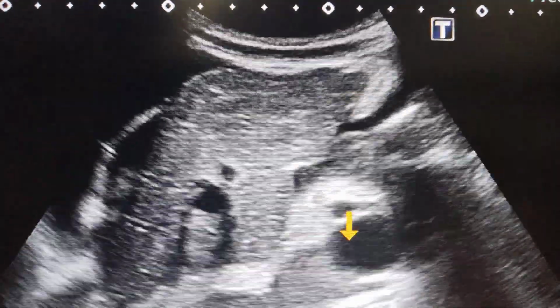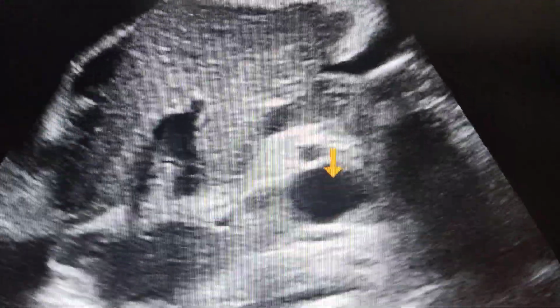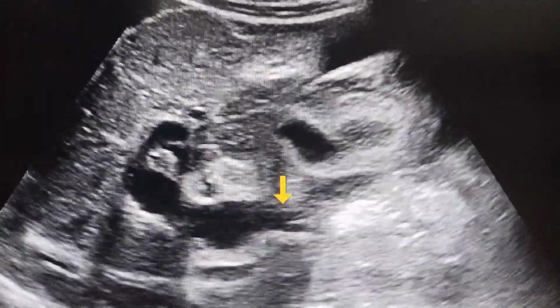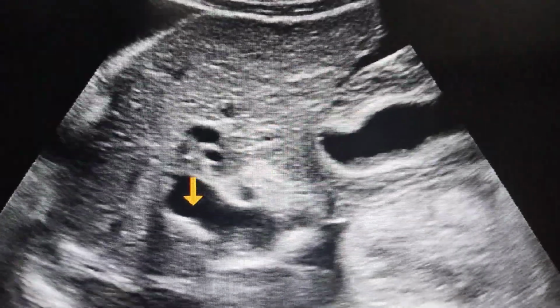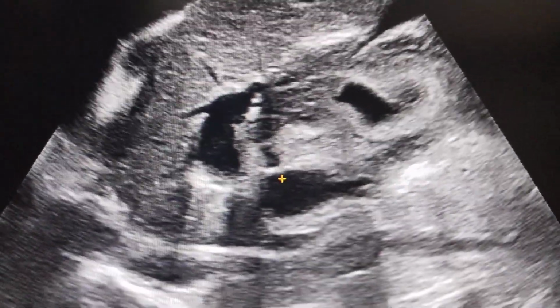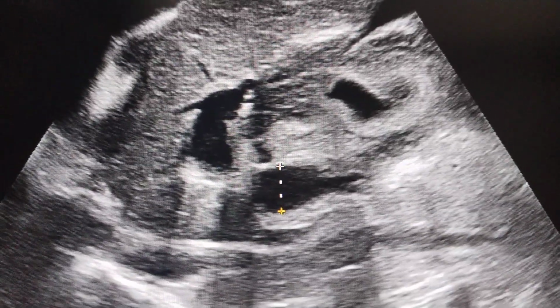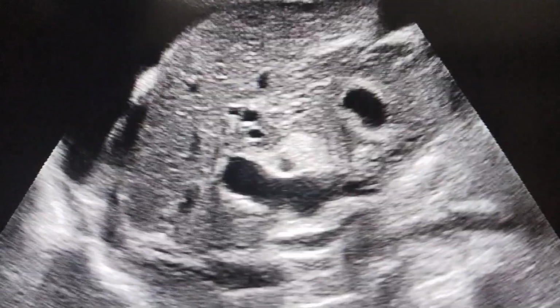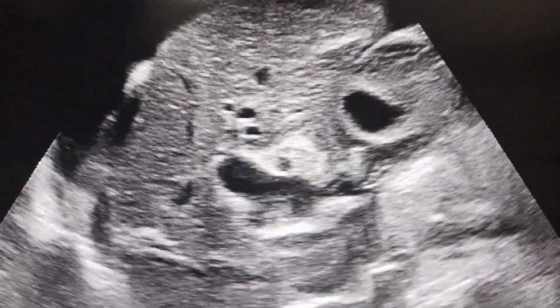And this is the portal vein, which is dilated. It is almost 15.8 millimeter.